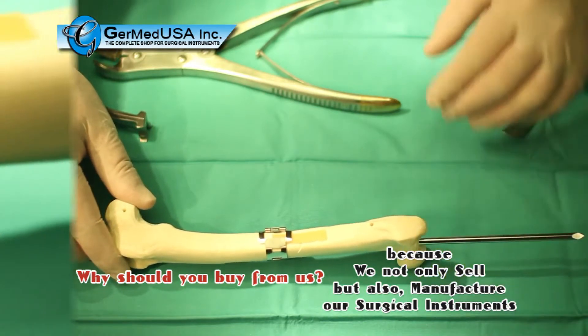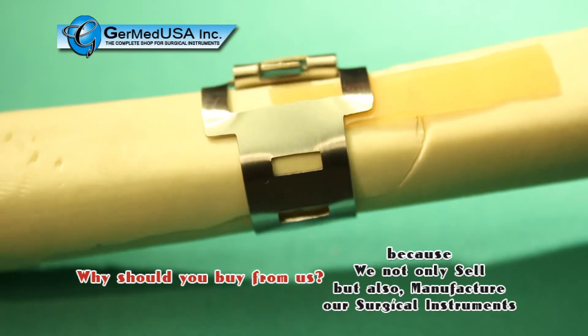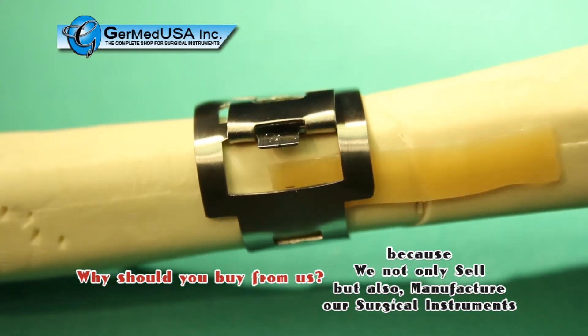For illustration purposes of this video, only one band was applied to this particular fracture. Ideally, in an actual patient, there would have been two bands on this size fracture.